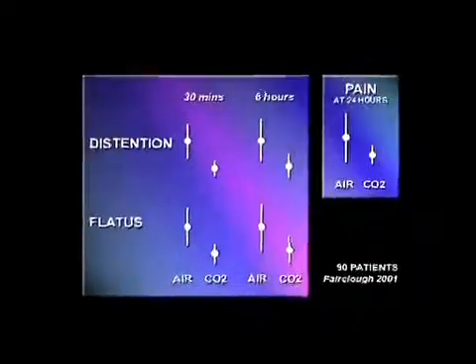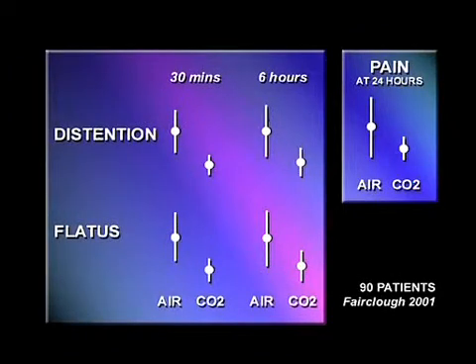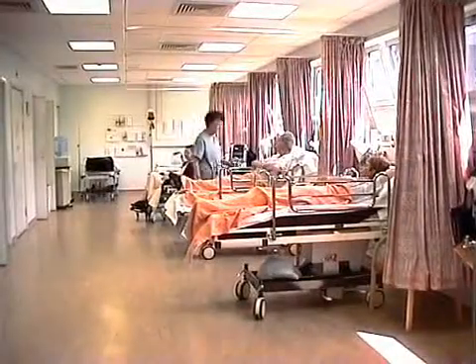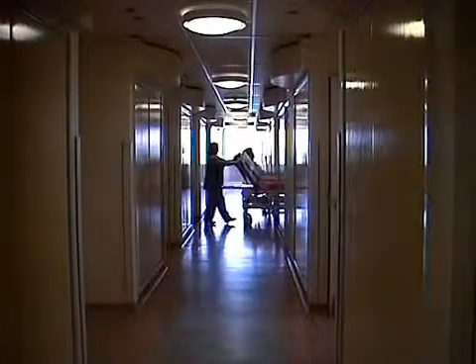Our experience and a clinical trial shows that using CO2 rather than air insufflation, patients have significantly less pain, bloating and flatulence. This bonus of using CO2 is apparent for up to 24 hours with less pain, probably because the colon has been less distended. Nurses appreciate CO2 insufflation because recovery is easier and faster.